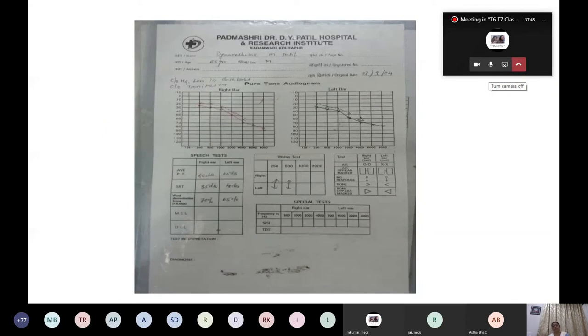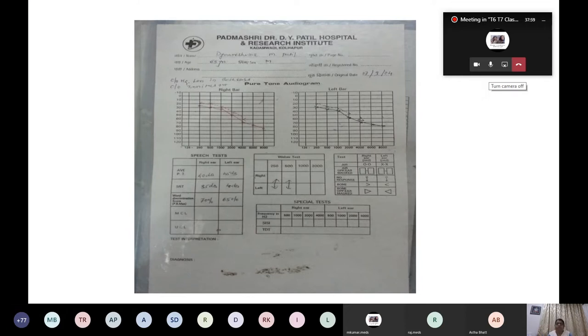Now we will look at audiograms available in the department — seventh term students should pay close attention. Whenever reading an audiogram, always start with patient name, age, and sex. Then systematically identify air conduction and bone conduction.